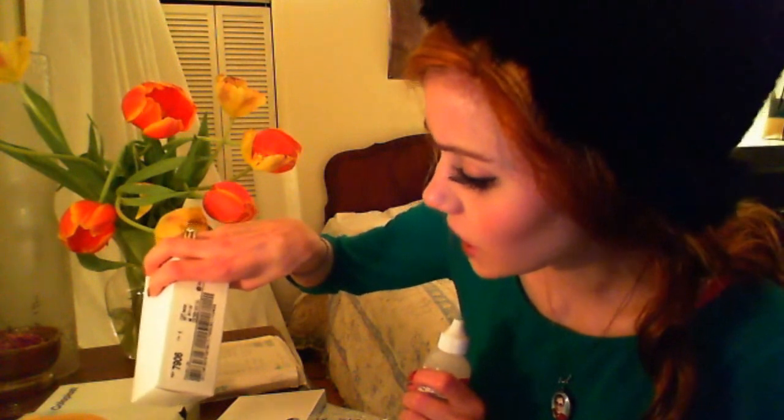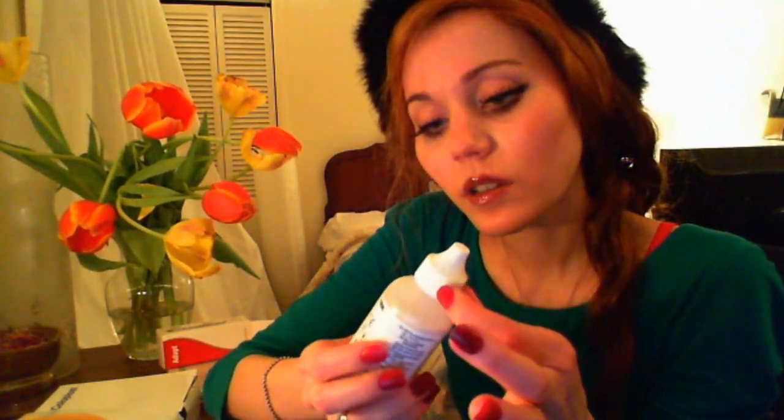Well, I would suggest using an Adapt product that is called Stoma Powder. And it sounds rather silly, but here's how it works. So you unscrew it, and then very carefully, around the little circle of your stoma, you dab powder on, all around the outside, making sure it does not fall on the rest of your tummy.